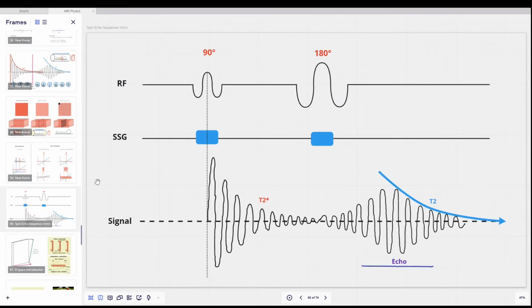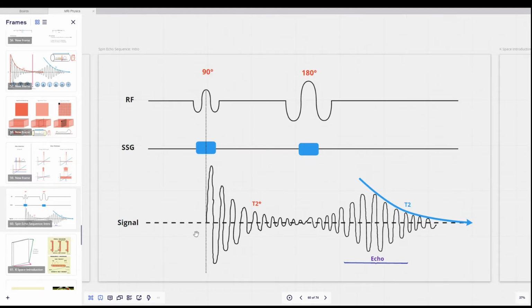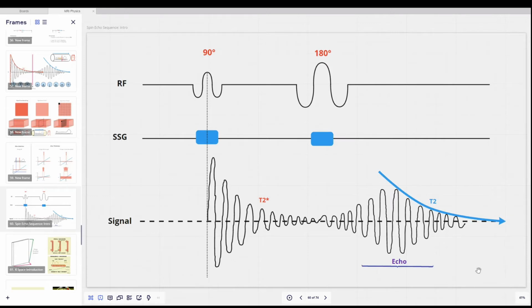Okay, new stuff. So this is actually nothing new. Again, I'm just mapping out here everything we've talked about up until now. Okay, so let's walk through this. This is over time, and I probably should have put a time marker at the bottom to illustrate that, but this is over time. Okay, so we have our RF pulse that we talked about, right? And at some time, we apply a 90-degree RF pulse, and that's illustrated by this curve here.